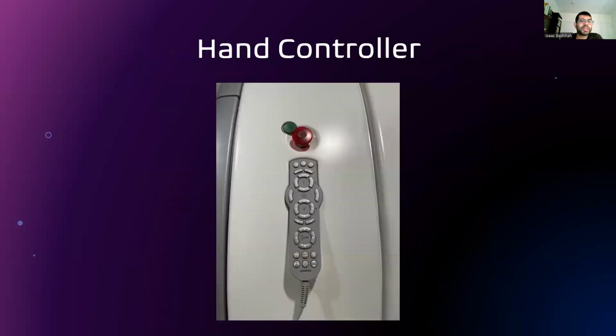I purposely did not cover this, which is probably the component you'll be manipulating the most, the hand controller. This component is best learned by using it, which will be done during the hands-on lab. You will each get time to practice and get comfortable manipulating the controls, as well as all the different parts of the gamma camera.